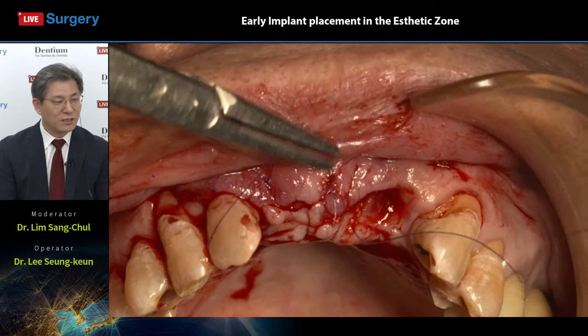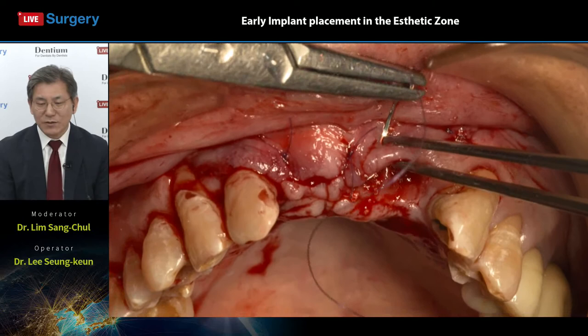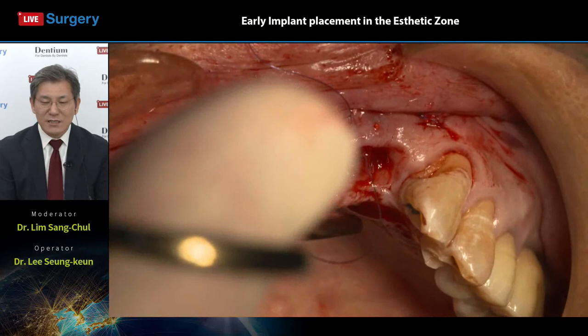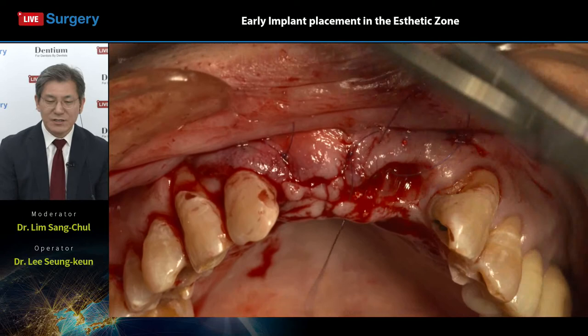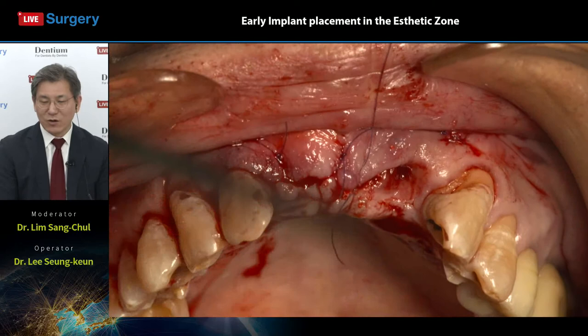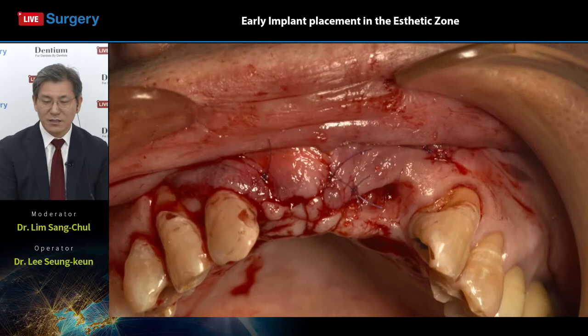When I have a GBR procedure on the upper anterior area, I always try the layer technique, according to Dr. Daniel Buser from Switzerland. Dr. Buser gave us a lot of evidence about the layer technique. Layer technique means the inside layer, in contact with the implant site, should be covered by autogenous bone, and the outer portion covered by alloplastic materials like Osteon 3 collagen. This makes for a successful GBR. The layer technique has a good benefit, lots of favors to us.